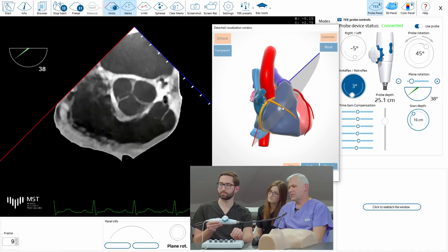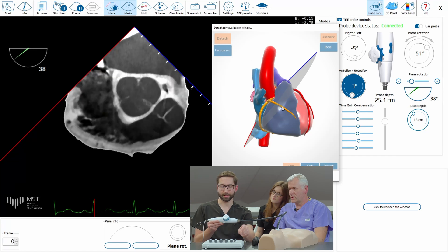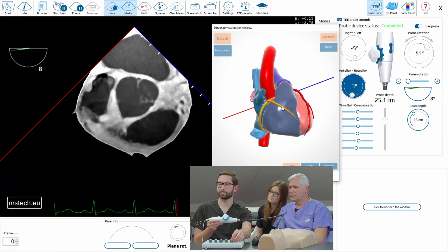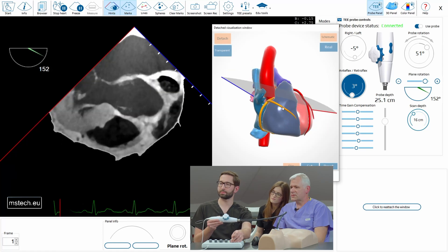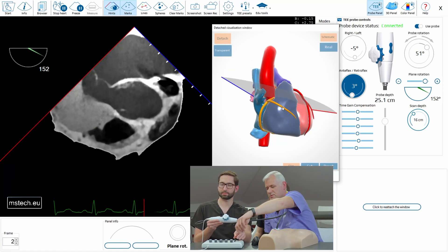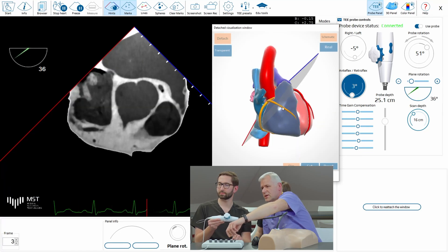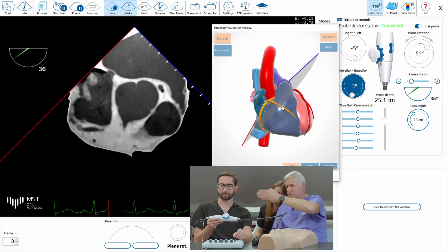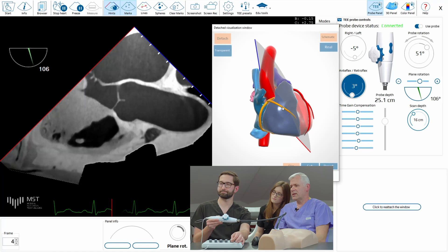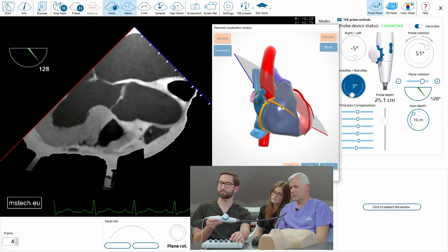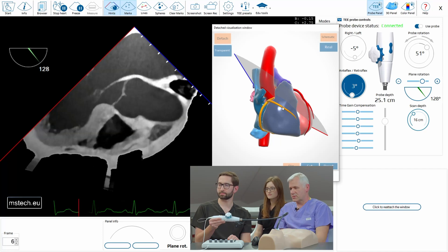So what do we have to do to see the long-axis view of the aortic valve? Because you started from 30 degrees more or less, what do you do to see the orthogonal view of it? 120 degrees — 126 or something like that. And then you will see the longitudinal view of the aortic valve. So more or less this is the view you are going to have.